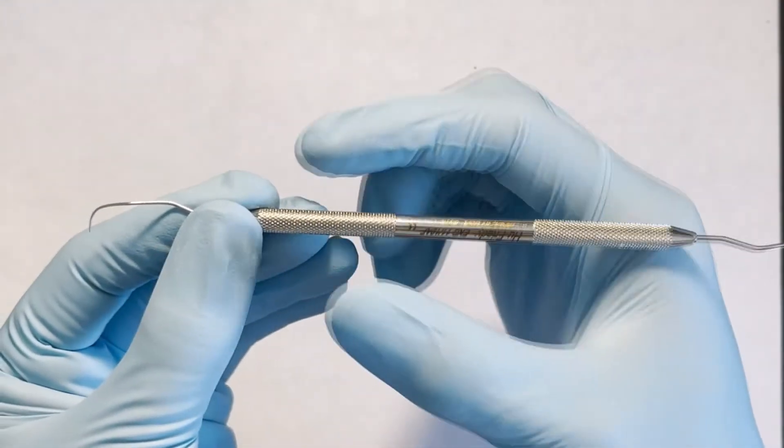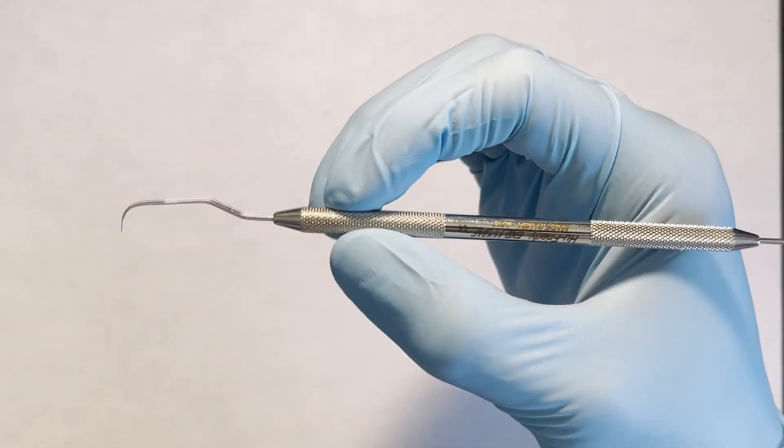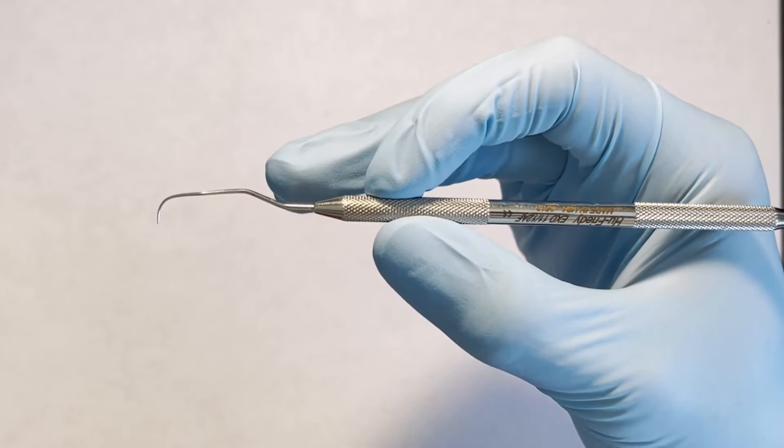Grasp the instrument along the knurling using a light, feather-like touch. The middle finger may be placed at the base of the shank for better tactile sensitivity.